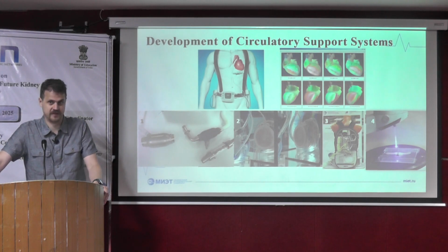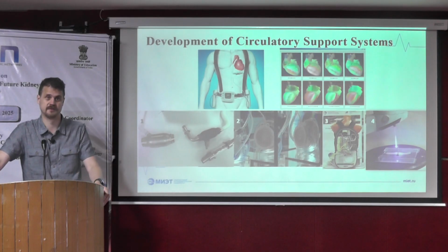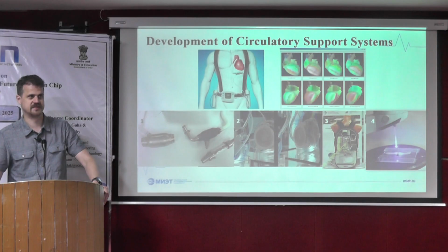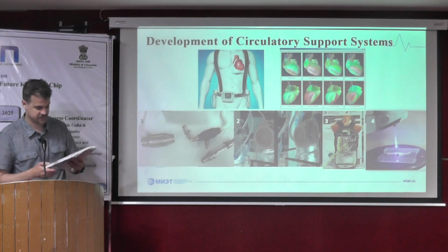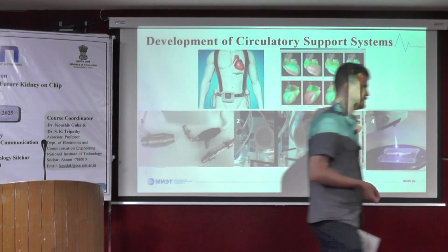It's the microfluidic systems that provide the reabsorption from the ultrafiltrate to the blood. So we have a lot of parts of the implantable kidney that have a direct interaction with the human blood, and of course we have to take into consideration that this issue has to be resolved by application of the anticoagulation surface to the internal surface of the device.